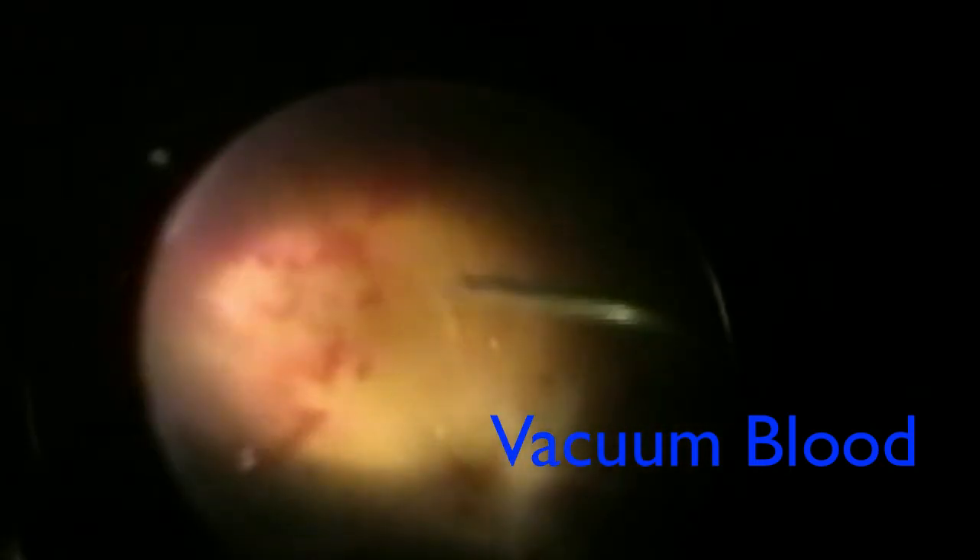This patient is on dialysis, and folks such as he can only stay flat in the bed and on the gurney for so long, so we have to pick and choose our battles. In this case, I elected to be happy with the result of reattaching the macula and going back to remove the formed vitreous gel as much as possible to prevent re-hemorrhage, and trying to release the traction from the bottom piece of the retina to the top so we don't develop a retinal detachment.